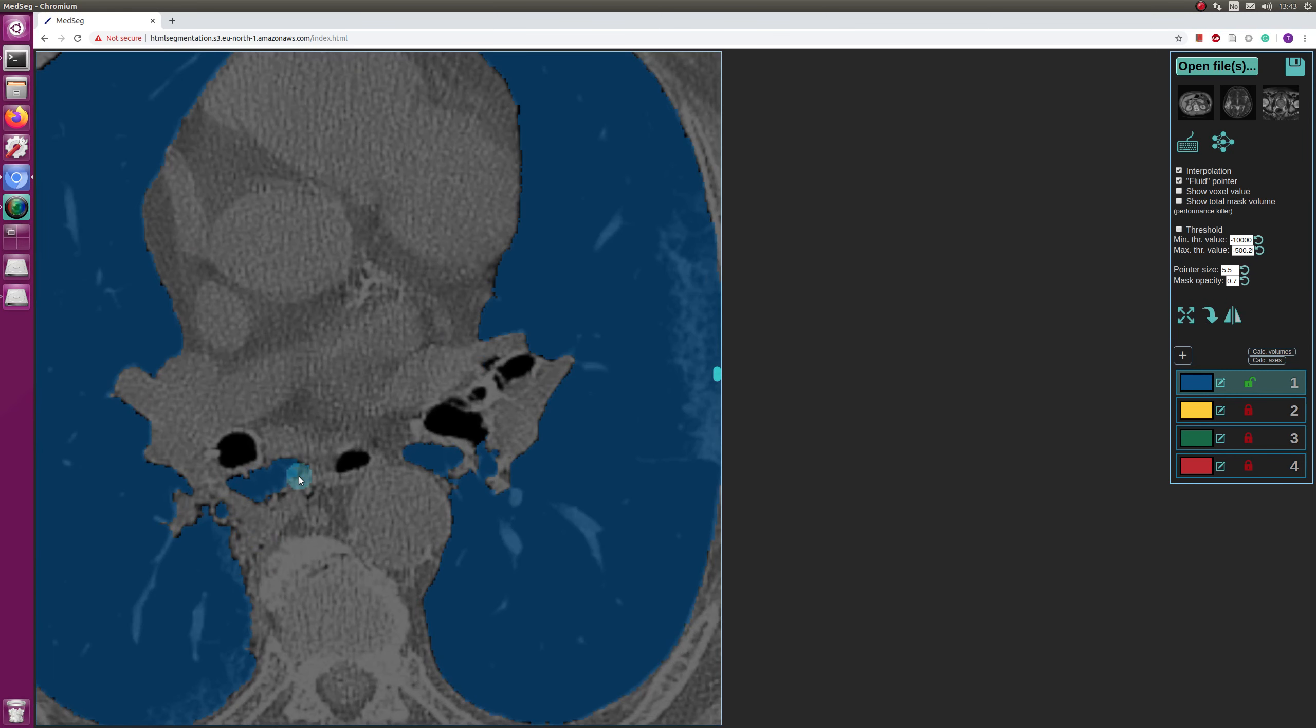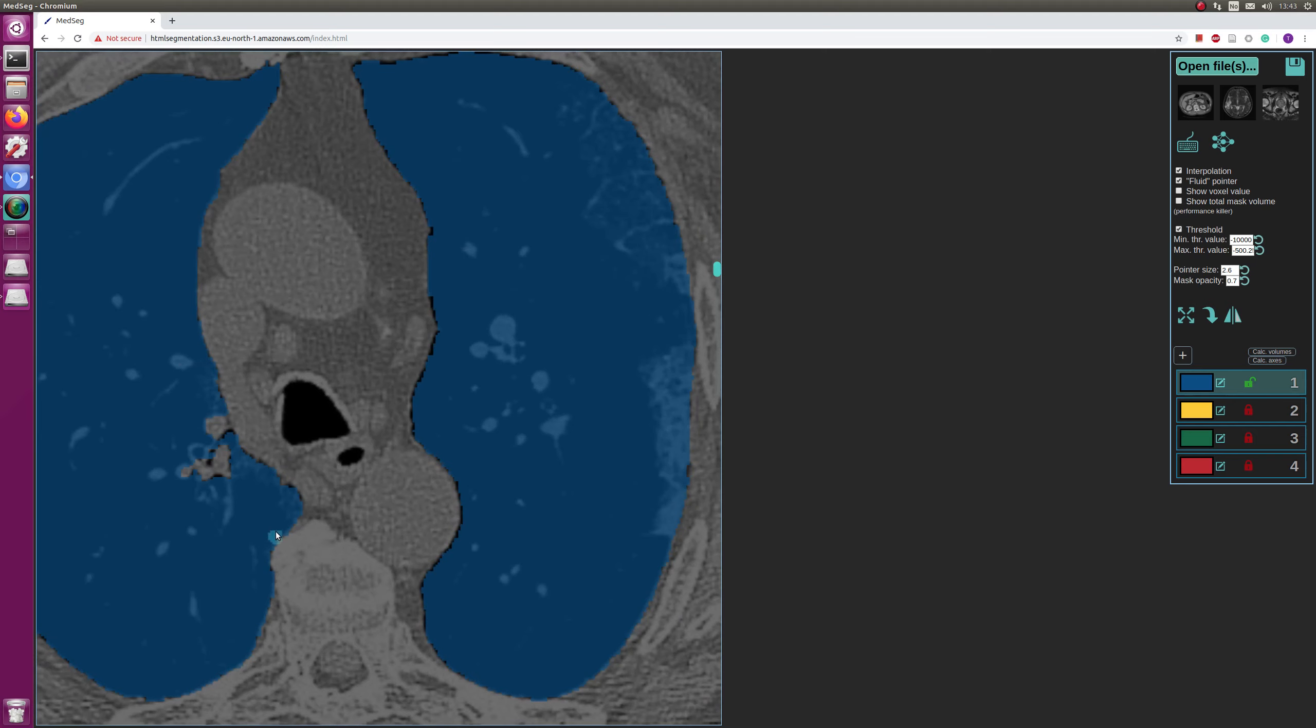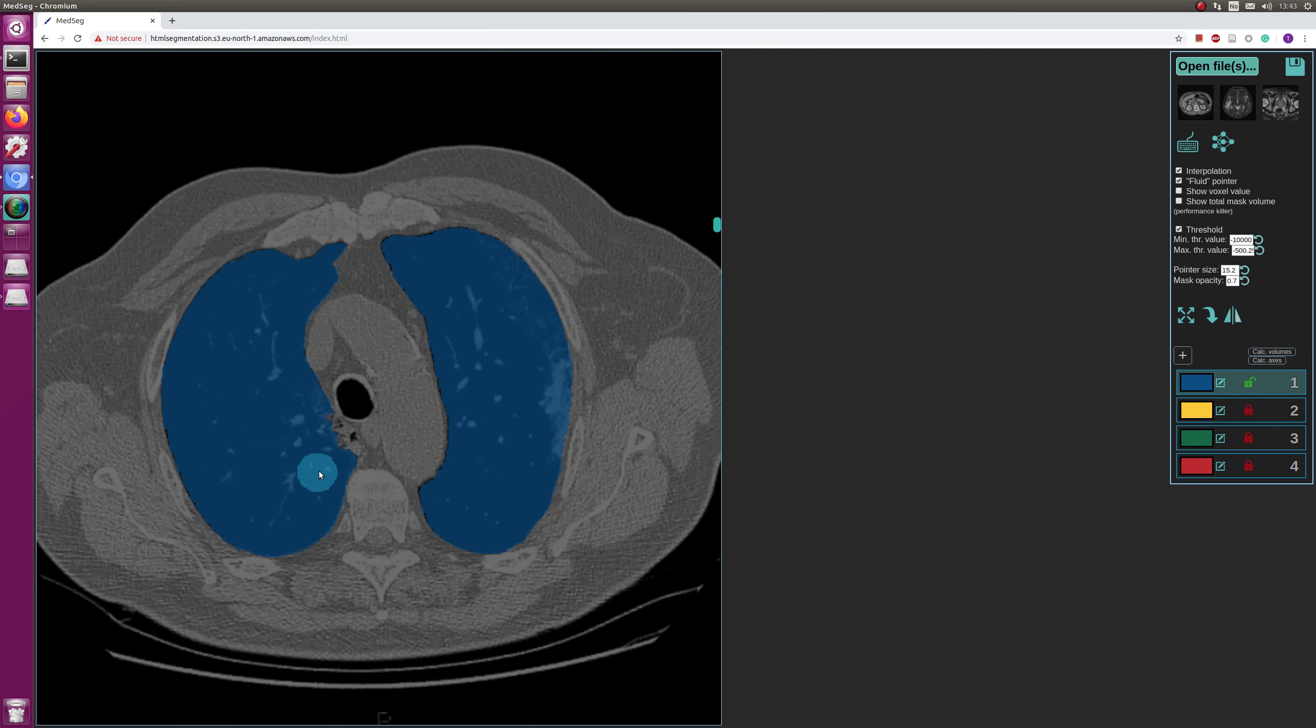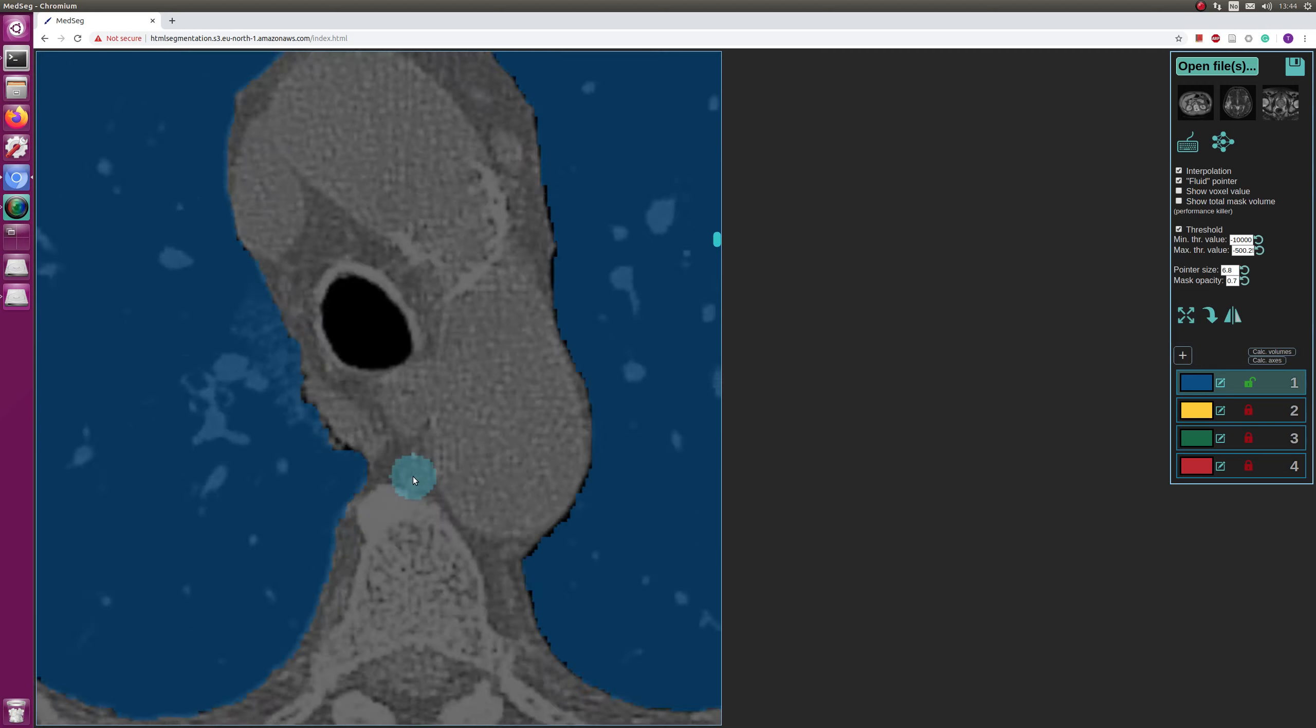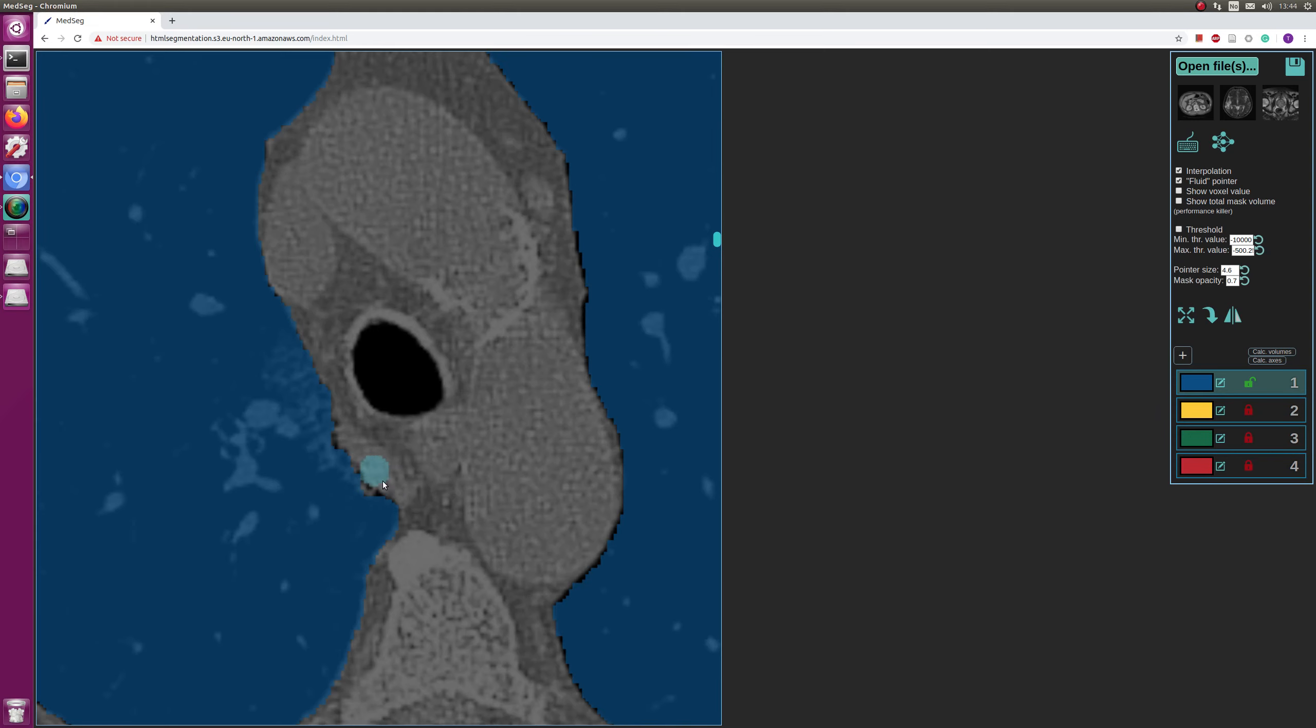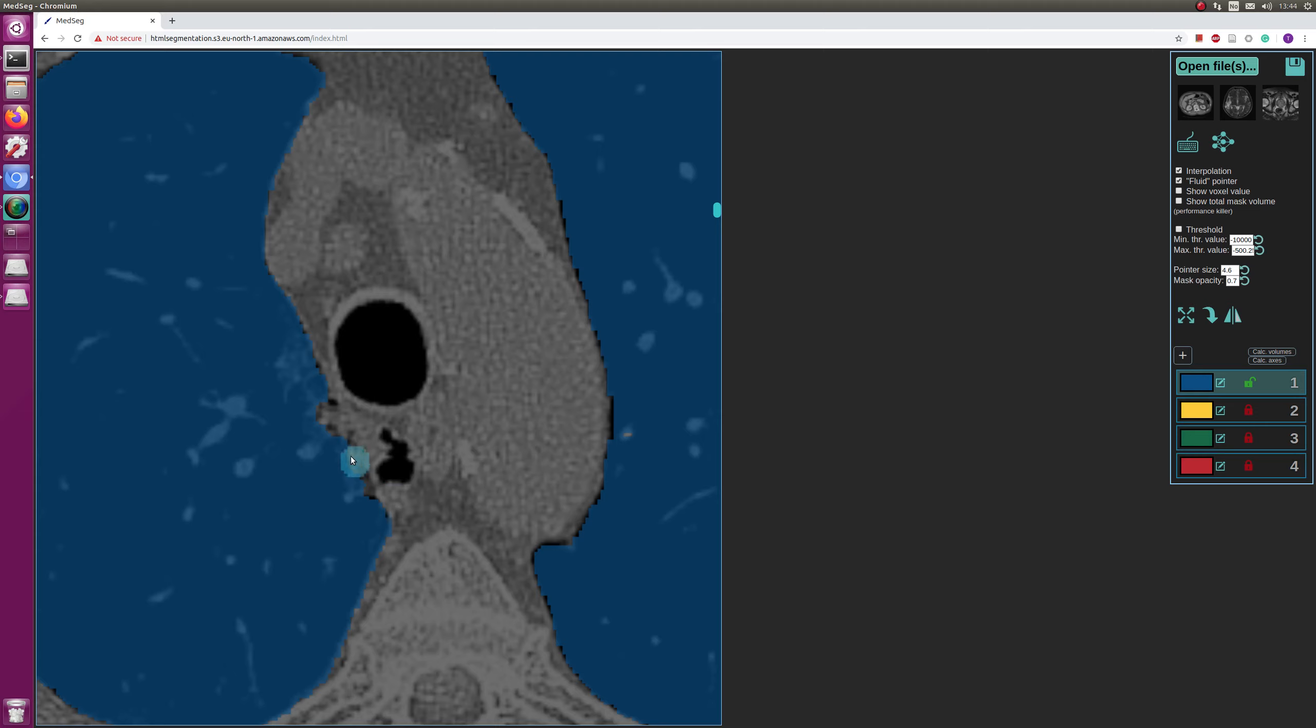Oh yeah, I forgot to correct all of this, which I think was part of the lung. This might be a vessel going right here. This is a small bronchus, probably. It's a good thing that this scan isn't too thin, so there's not too many slices to correct. I really don't like when it starts... I was going to say it starts taking the esophagus, but this is actually our lung, and I think that's the azygos vein which goes in right here and goes around, and this is lung tissue.